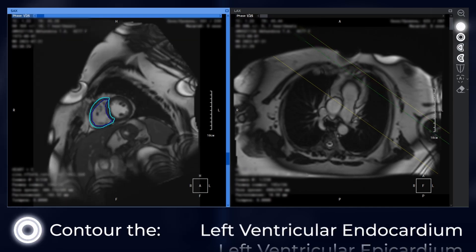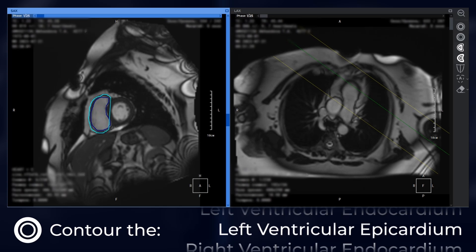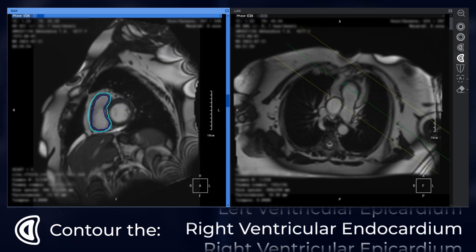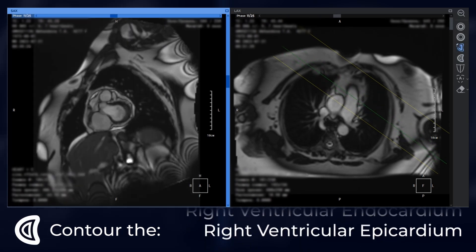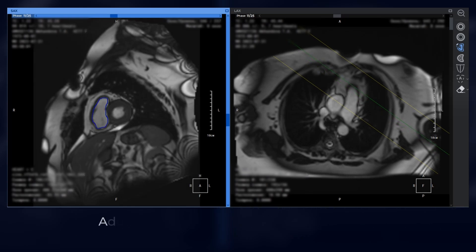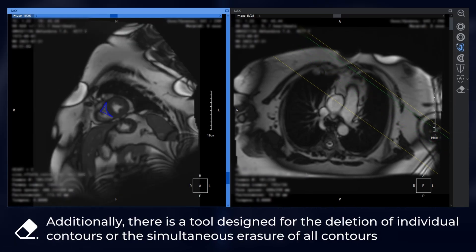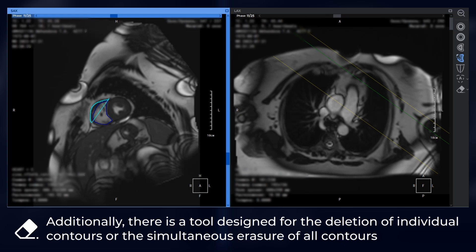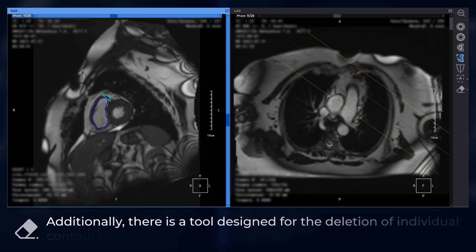The four tools allow you to contour the left ventricular endocardium, left ventricular epicardium, right ventricular endocardium, and right ventricular epicardium. Additionally, there is a tool designed for the deletion of individual contours or the simultaneous erasure of all contours.